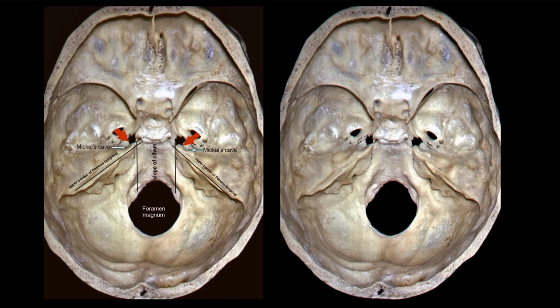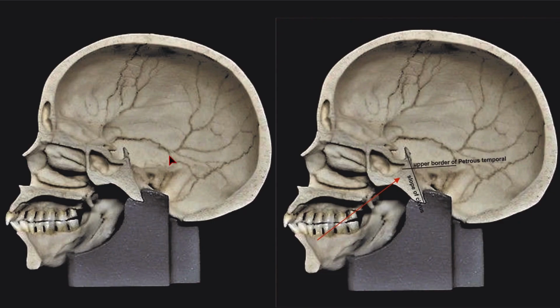So now you see in the lateral view, you can see this is the sella turcica, clivus, this is the petrous, body of the sphenoid, sphenoidal sinus, this is the slope of the clivus, petrous, posterior clinoid process. So that is the junction, towards the junction of the clivus and petrous, where you will get the foramen ovale. See here.